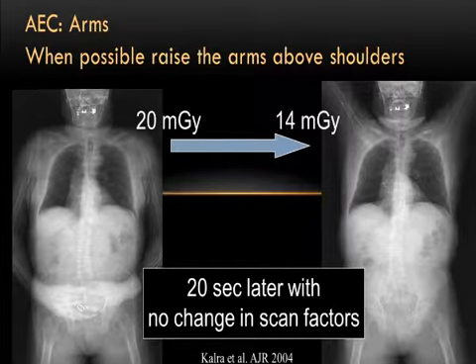The reason is that you would increase the lateral dimension of the patient. Already you know that the noise in the image is affected by the projection that has the highest attenuation. If it was me, where my attenuation is maximum laterally, and I place my arms like this, I'm doubling my attenuation. So not only am I increasing the noise and the dose, but I'm also going to cause more streak artifacts or beam hardening artifacts in this direction. So that's something to remember.